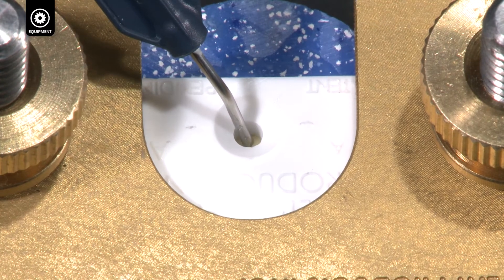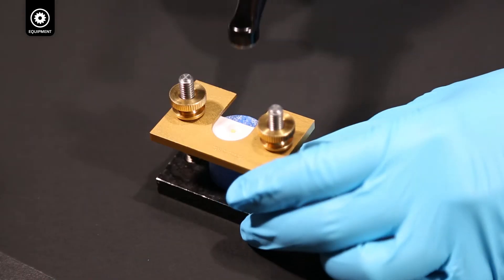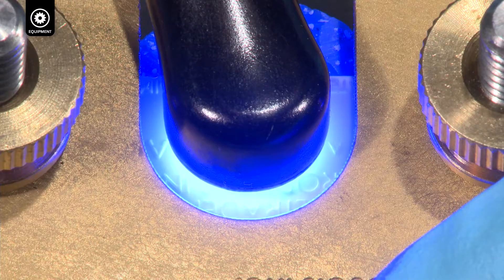Fill the mold three quarters full with composite. Do not fill above the beveled edge of the mold. Light cure for 20 seconds with BALO in standard power mode.